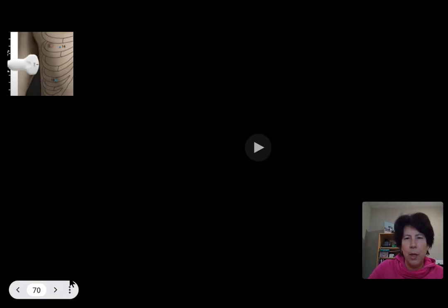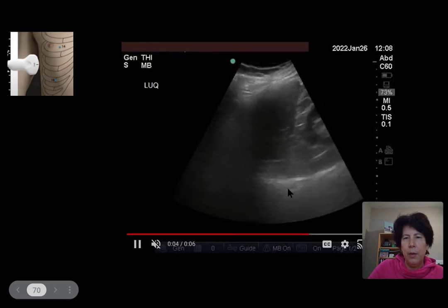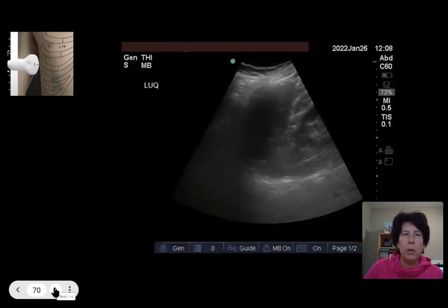And then our next loop, that's our last loop, I think, for the study. This is on the left. So spleen is usually, you don't get as good a window for your ultrasound. We still see our spine, see our kidney, spleen, our diaphragm is here, no fluid here, and we're looking for that curtain sign, but again, not super visible. Okay, and that's what a normal study would look like that you'd record for us.